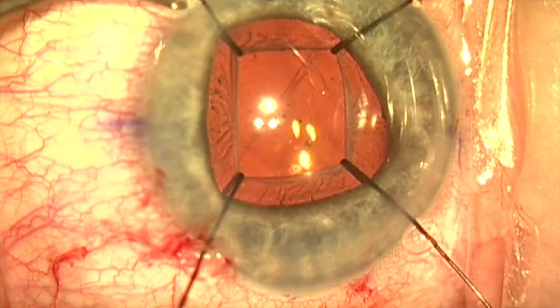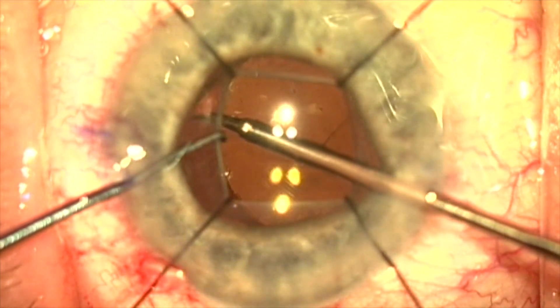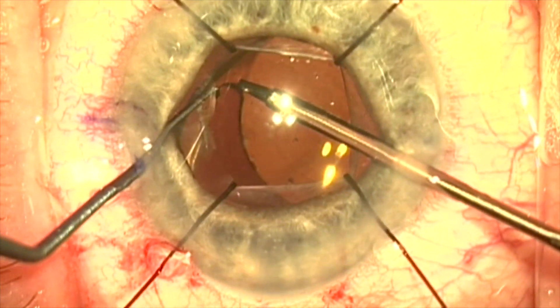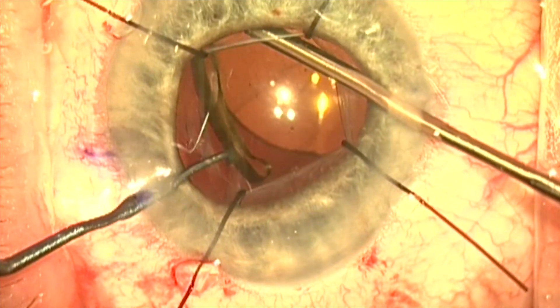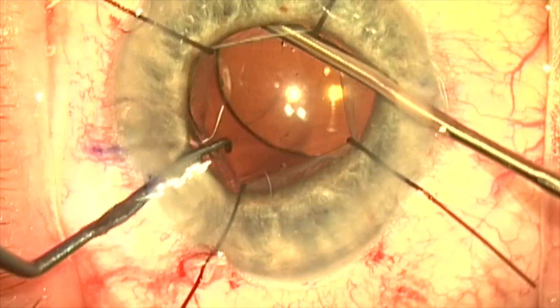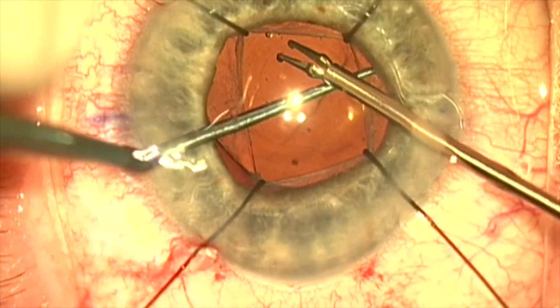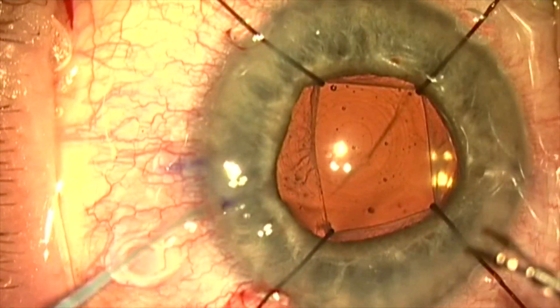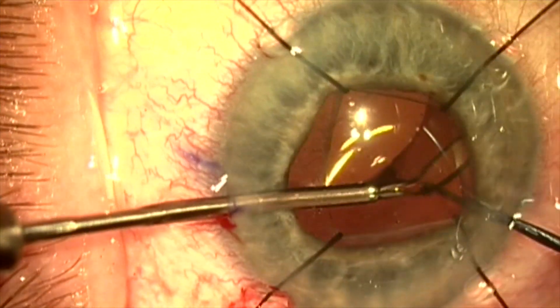Here we're going to stretch the anterior capsule a bit. Now I'm going to use a micrograsper and grab the haptic-optic junction and try to free up the haptic, which is fibrosed at the terminal bulb. You can see I'm sweeping this fibrosis off — the zonules are very weak in this area, so I have to be very careful. Once this side is freed up, I'm going to free up the other side and make sure the lens rotates and is freed up without any adhesions.